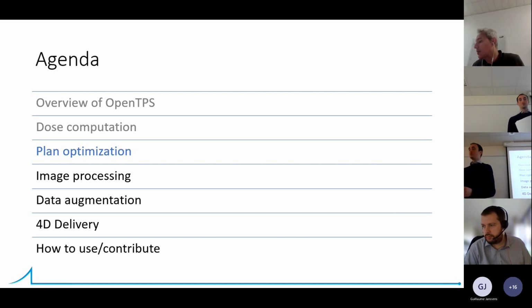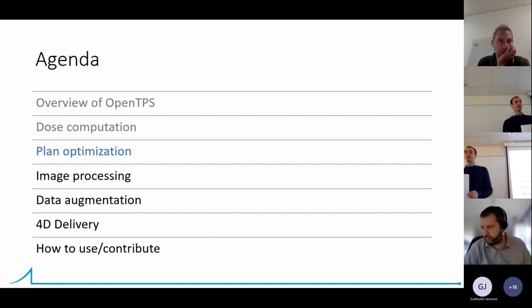Okay. True, I did not write any slide on the license. You will find the license on the GitLab, actually, and there are two licenses. The core library is fully open source. It's Apache 2.0 license. This means that you can do whatever you want with the core library. You can build your application. If you want to sell it, you can even sell it. That's a very permissive license. So it's not even mandatory to have your code open source. So you can really do whatever you want.